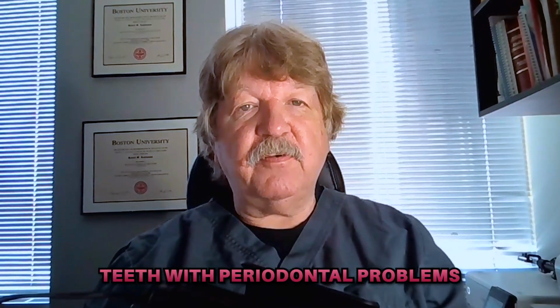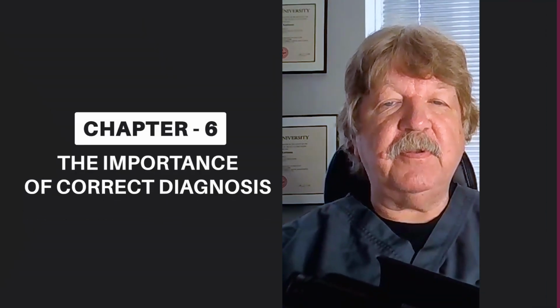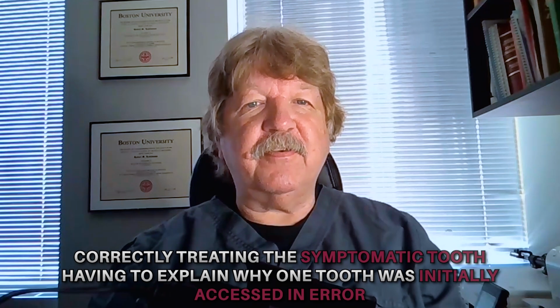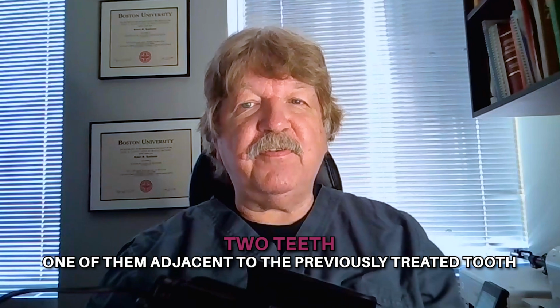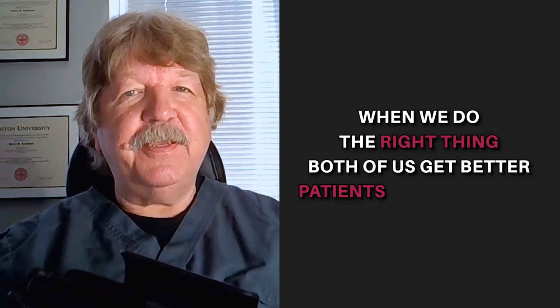By using a cavity test, we ensure that teeth with periodontal problems are diagnosed properly and not incorrectly diagnosed and endodontically treated for a condition which is unrelated to any endodontic pathology. In acute cases, when we are asked to do something to help the acutely involved patient, this can mean the difference between correctly treating the symptomatic tooth or having to explain why one tooth was initially accessed in error and now two teeth, one of them adjacent to the previously treated tooth, now require treatment. Remember, when we do the right thing, both of us get better, the patient and the clinician.